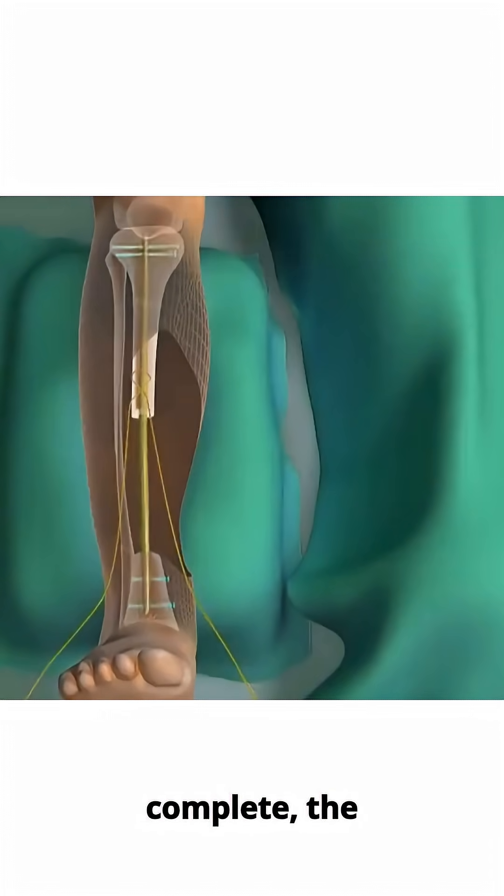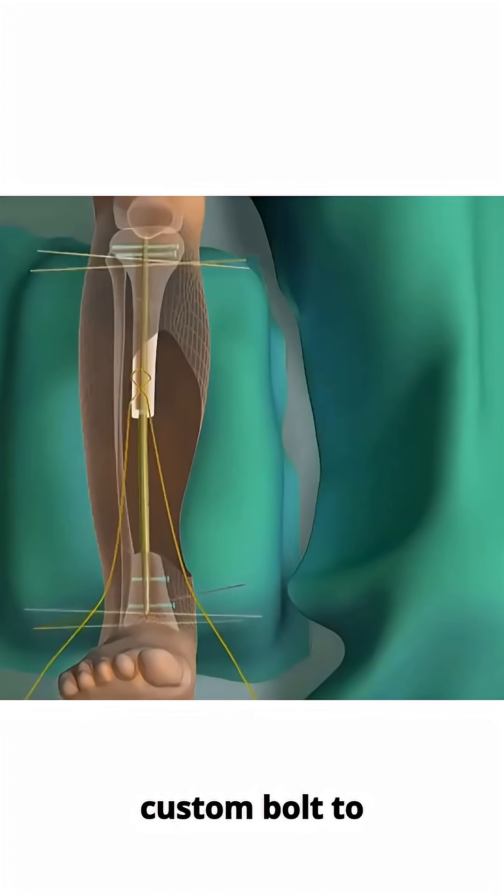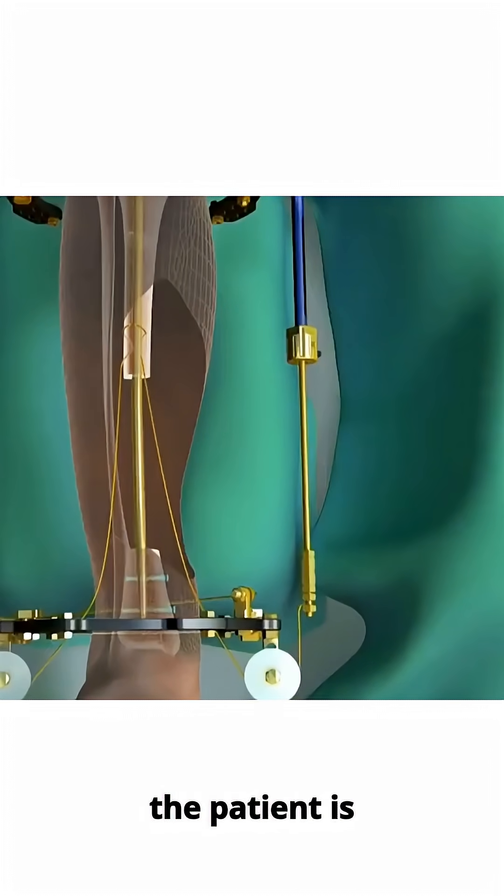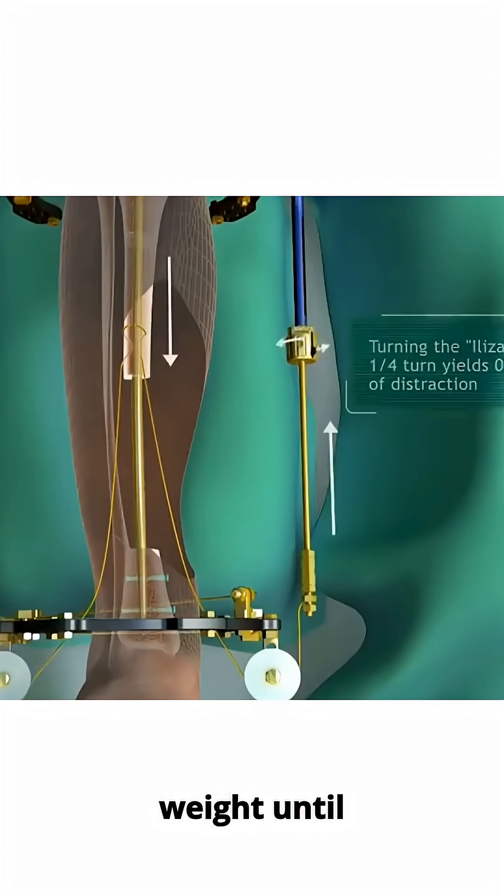Once the lengthening is complete, the bone is secured with a custom bolt to prevent shifting. The frame is removed and the patient is allowed to partially bear weight until fully healed.